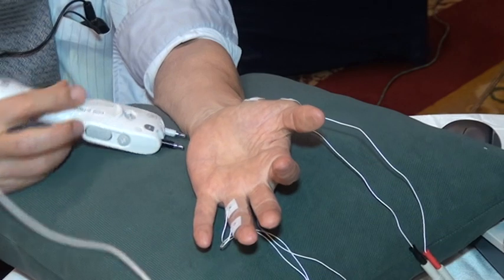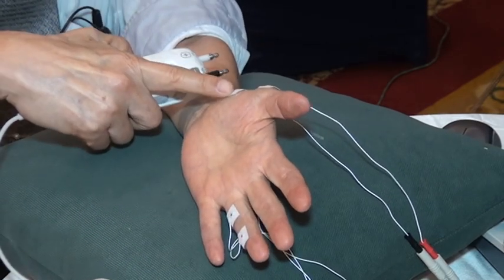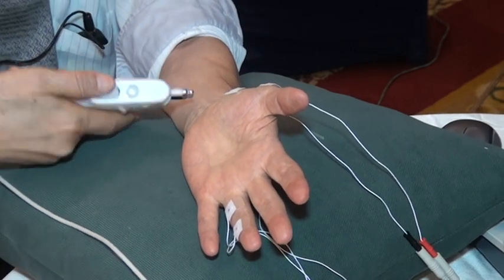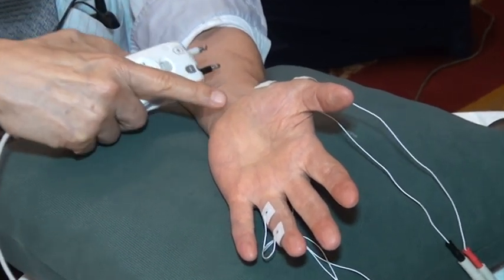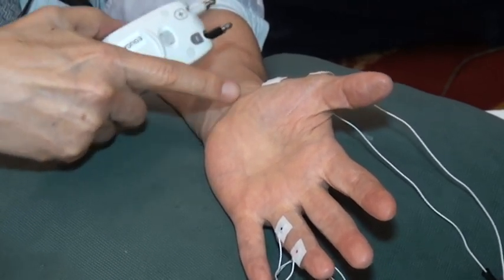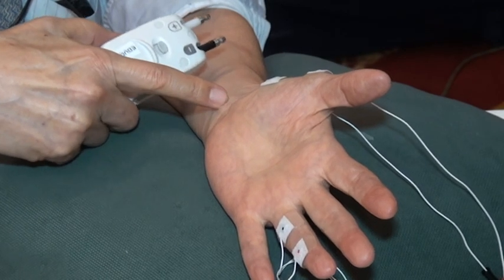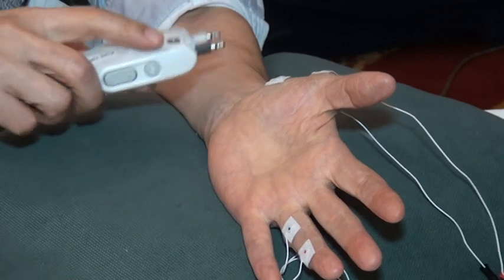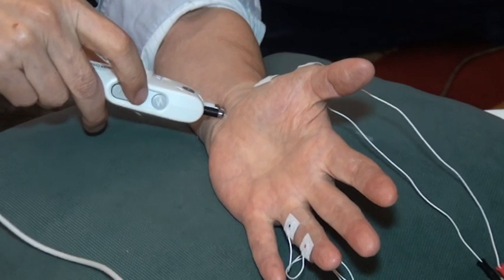And the rule is negative electrode facing the pickup electrode, rather than the other way around. Negative electrode faces the pickup electrode. And we stimulate 3 centimeters above the distal crease. That is the only landmark we use, 3 centimeters above, right in here. And I can control the intensity.